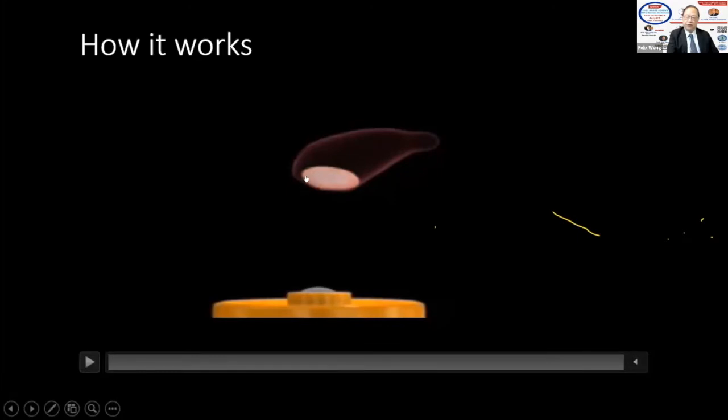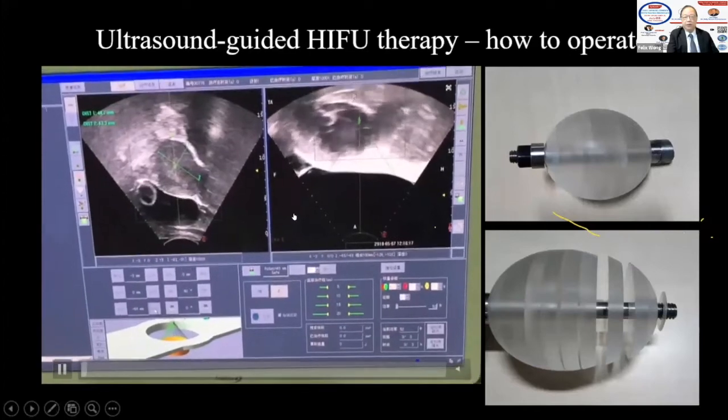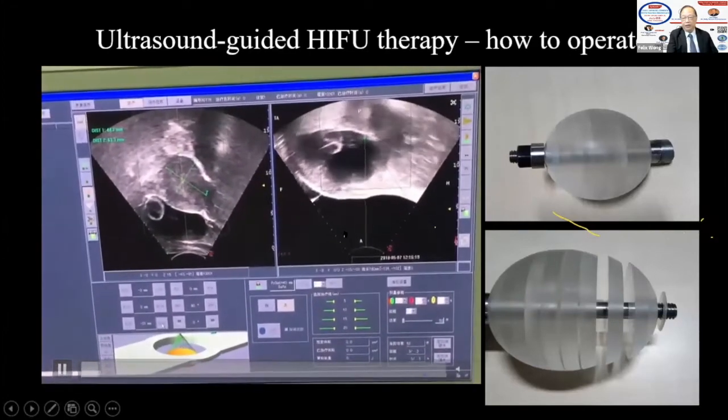We should burn the caudal side, the foot side, and then go to the head, because in this way the patient will have less pain, because the sacrum and the lower spine are here. Sometimes the radiation heat can cause pain in the patient.